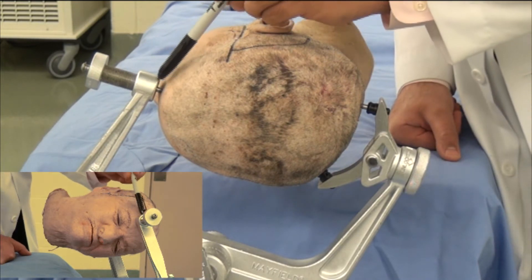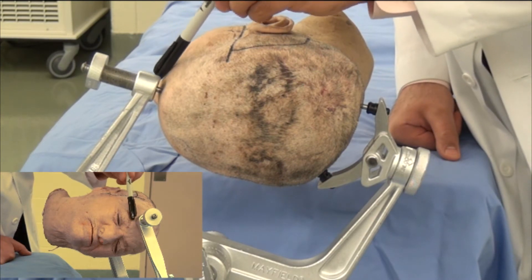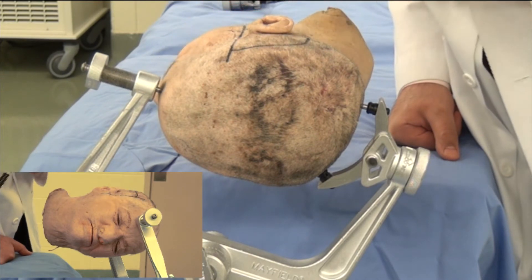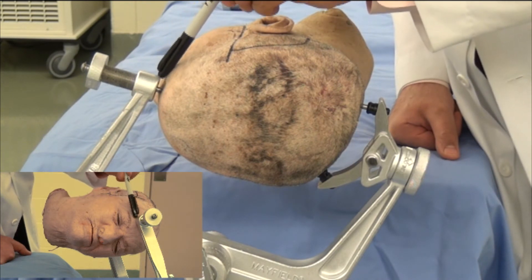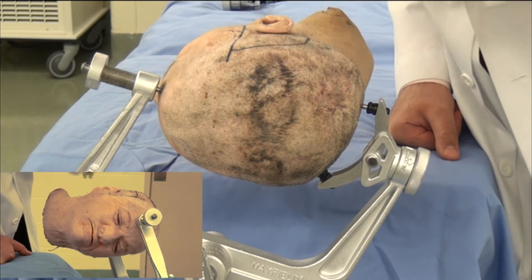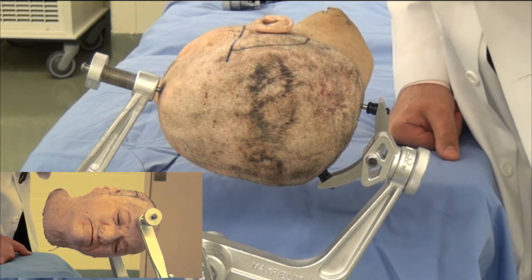As you can see, one of the pins is placed along the forehead above the eyebrow, avoiding any potential slippage which could unfortunately slip the pin into the eye. The pin is placed at least a centimeter or more above the eyebrow, as laterally as possible, in order to hopefully avoid a large frontal sinus.